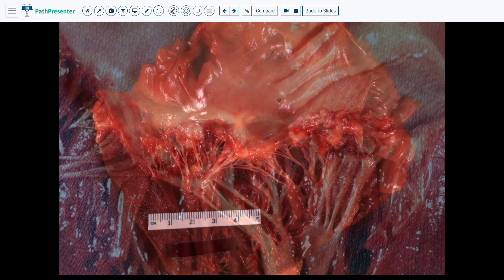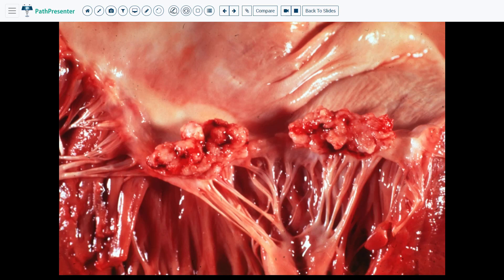Case 4 is bacterial endocarditis. The wall of the left atrium is up here — I can tell because it is quite smooth. Here is the mitral valve and the chordae tendineae. The pathology is these very large vegetations on the mitral valve leaflets. These vegetations are friable, meaning they fall apart when touched. These large vegetations can fragment, enter the systemic circulation, and cause infarctions in systemic organs such as the brain where they can cause cerebral infarction.